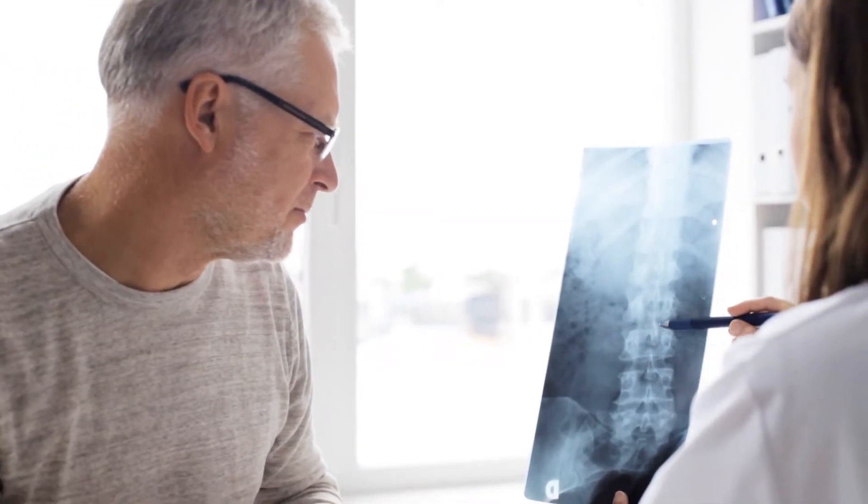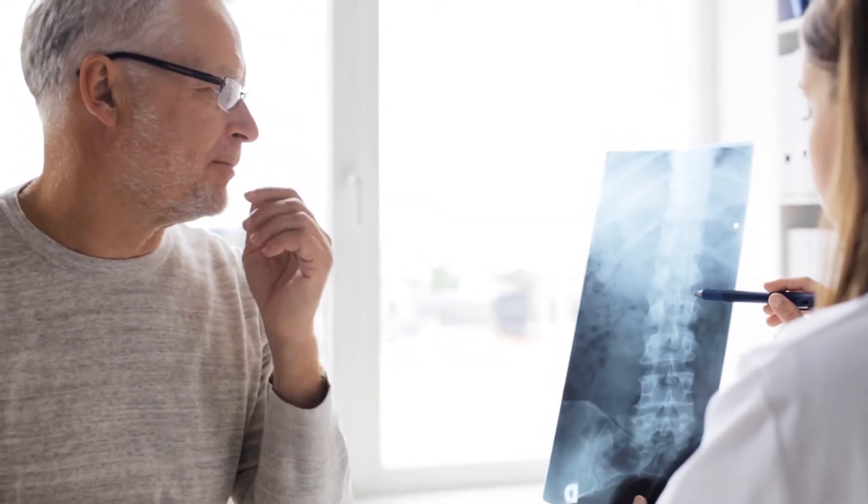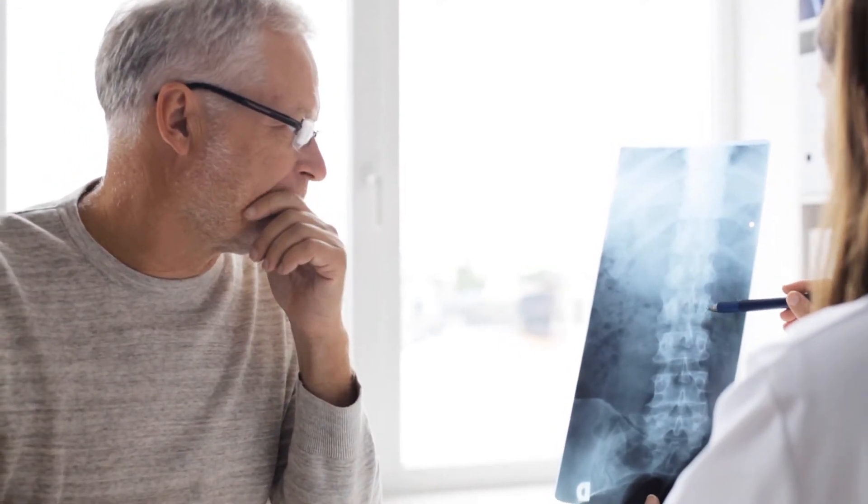Spinal fusion surgery is used to stabilize vertebrae in order to take pressure off nerves and relieve back pain. Traditional spinal fusion surgery required long incisions and even longer recovery times of up to several months.